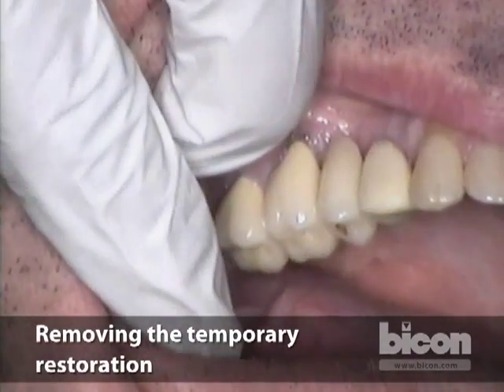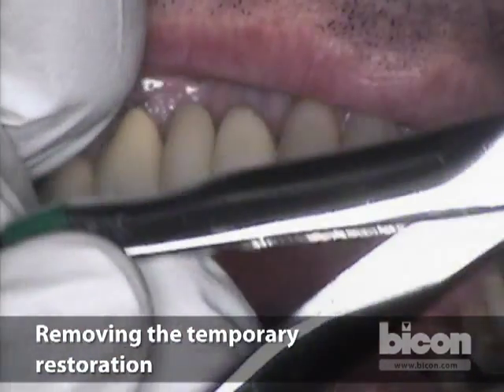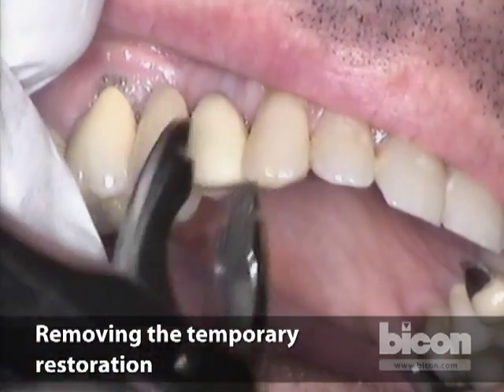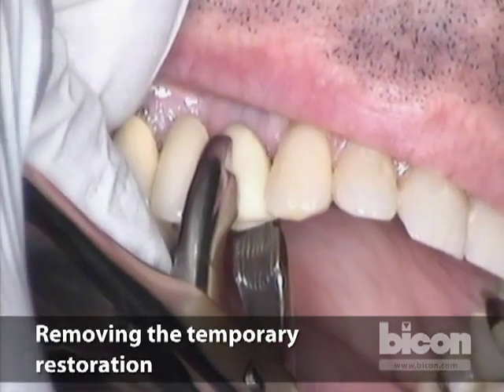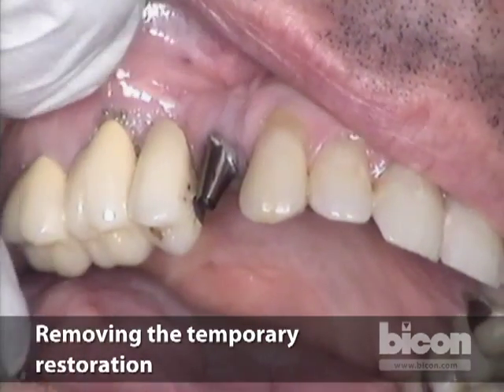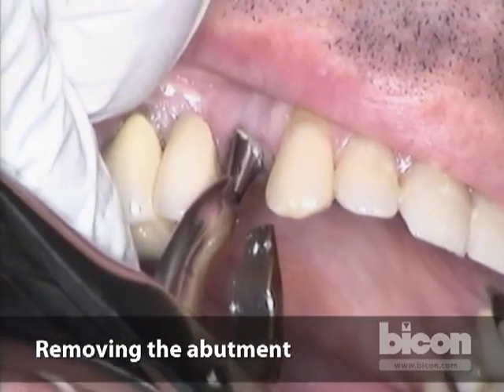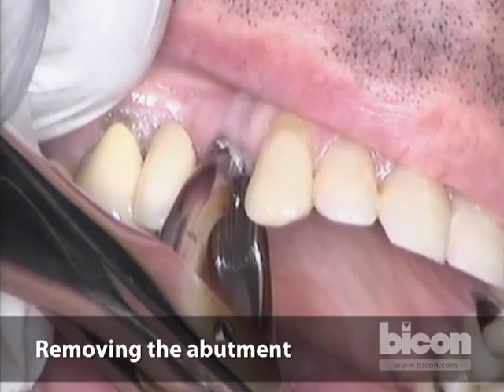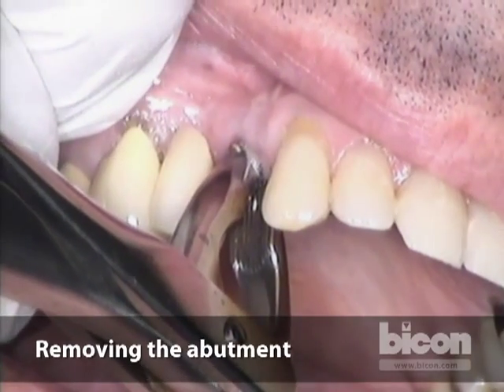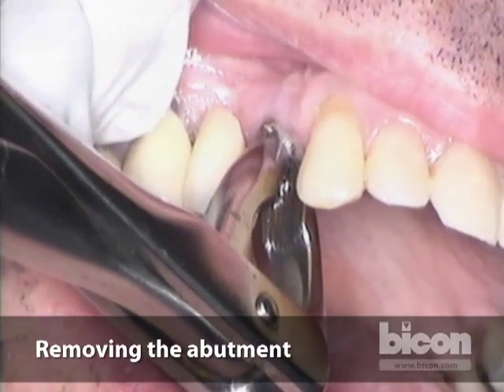We're going to begin by removing the temporary restoration. You can grab it with crown removal forceps — this one with a flat surface I really like — then just grab the crown and pull. Sometimes the abutment comes out with the crown, sometimes it doesn't. To remove the abutment, you grab both sides and you can tap onto the instrument with a hammer, or alternatively just rotate on the abutment and pull — you don't want to torque, just rotate slightly and pull.